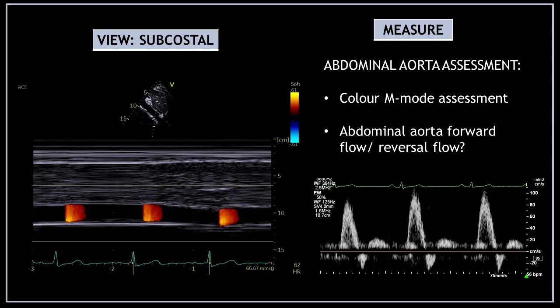At this point you can also use color M-mode and pulse wave Doppler to assess the abdominal aorta forward flow and to check for any reversal flow.